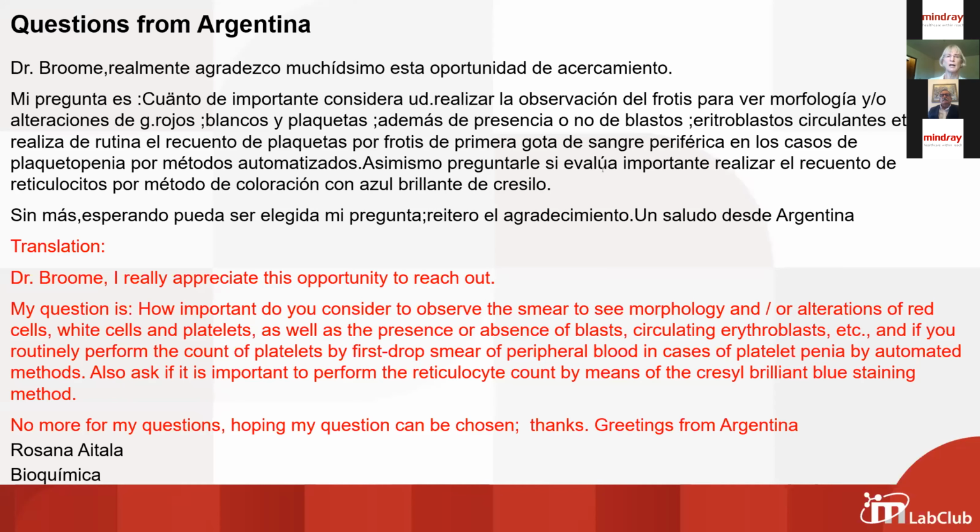Let's see what else. Abnormal white cells. Again, increased immature granulocytes is the most common cause. Most of the high-end analyzers quantify immature granulocytes very reliably.